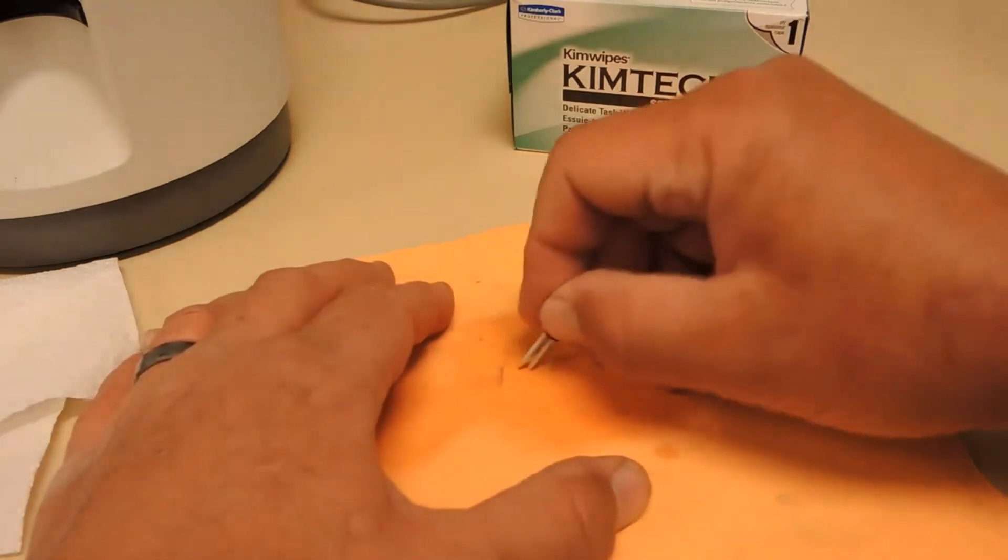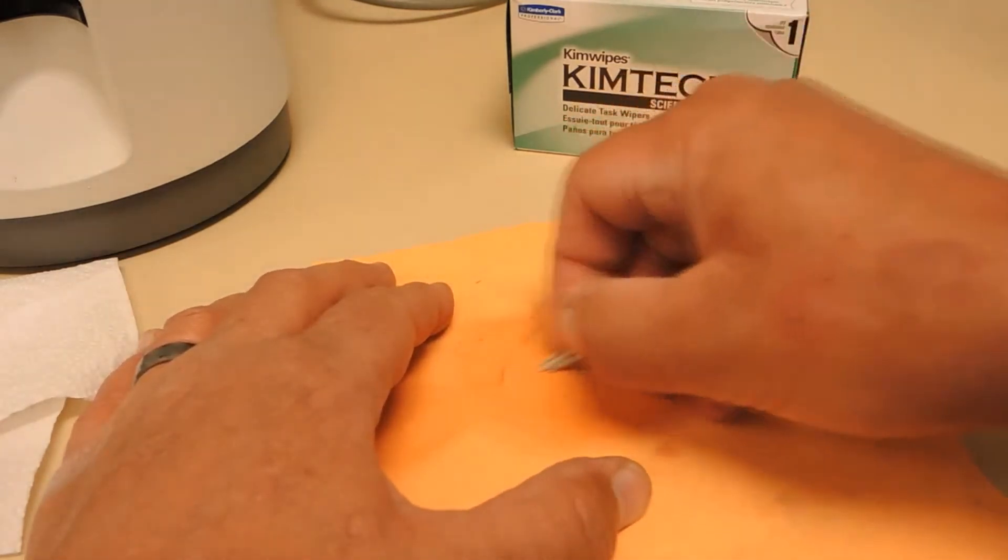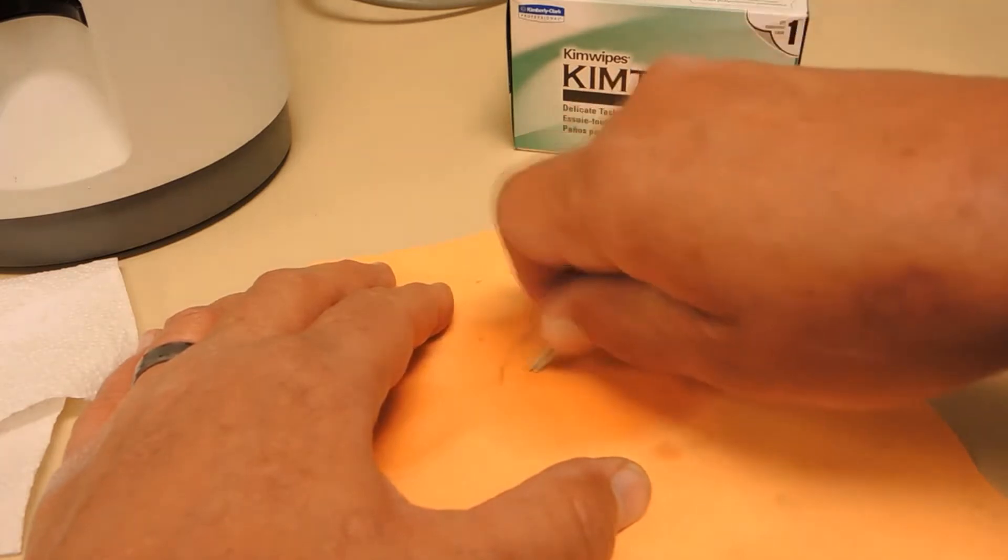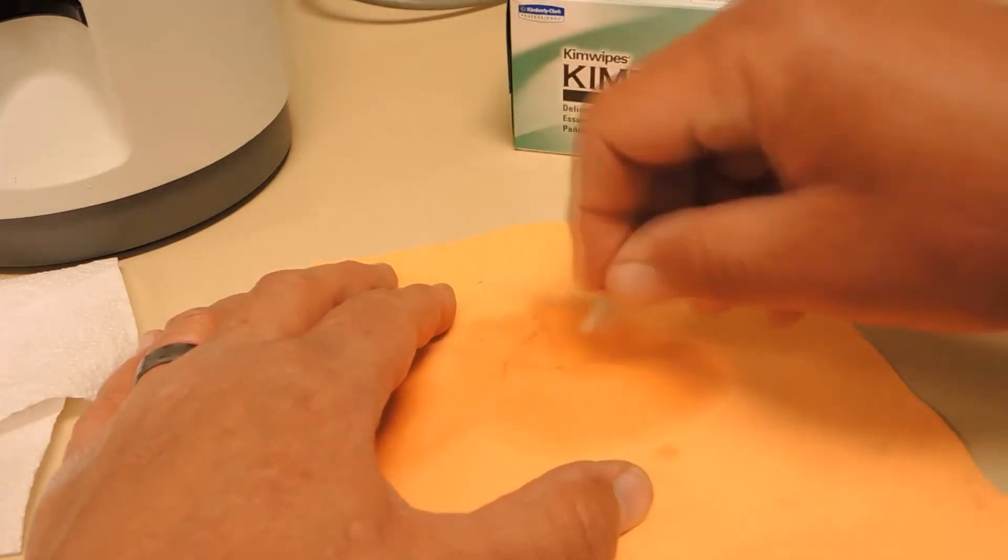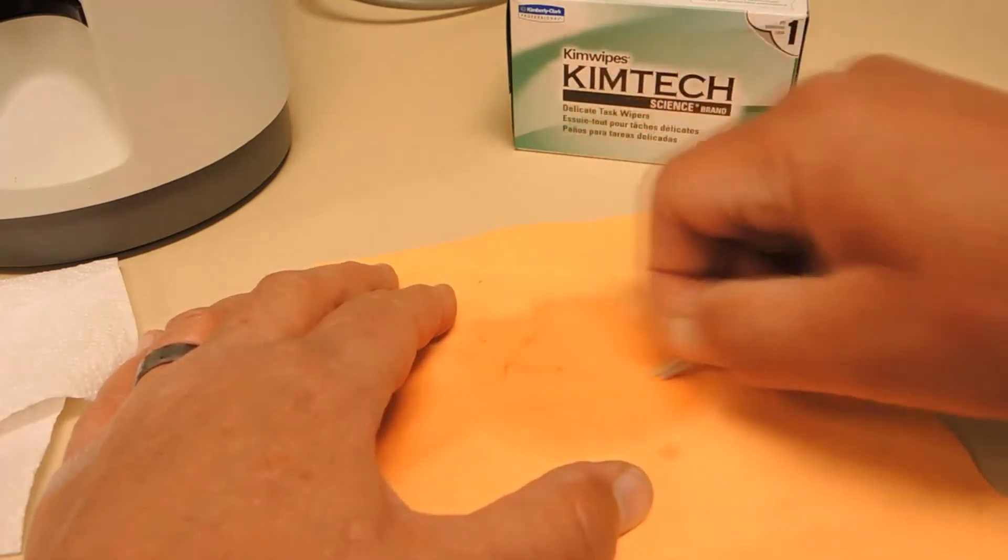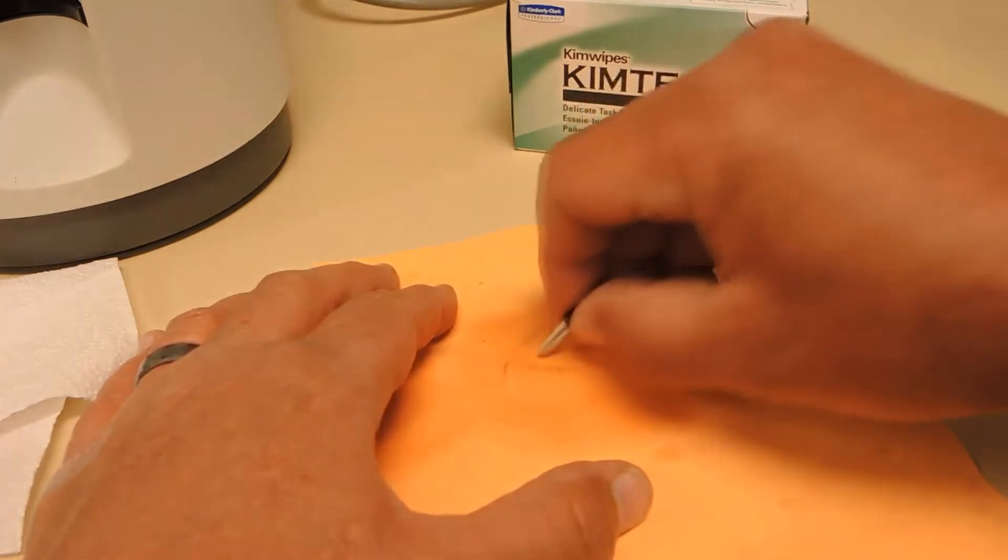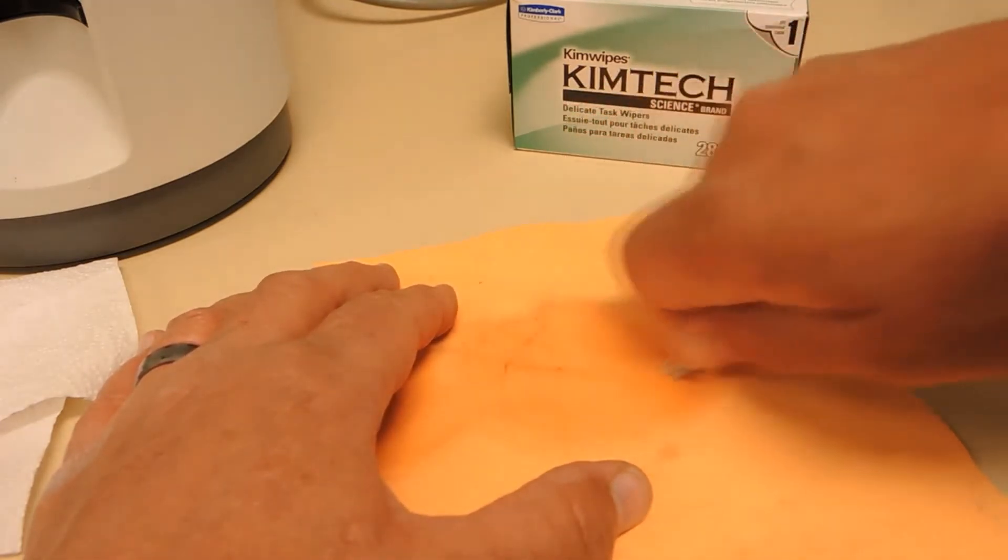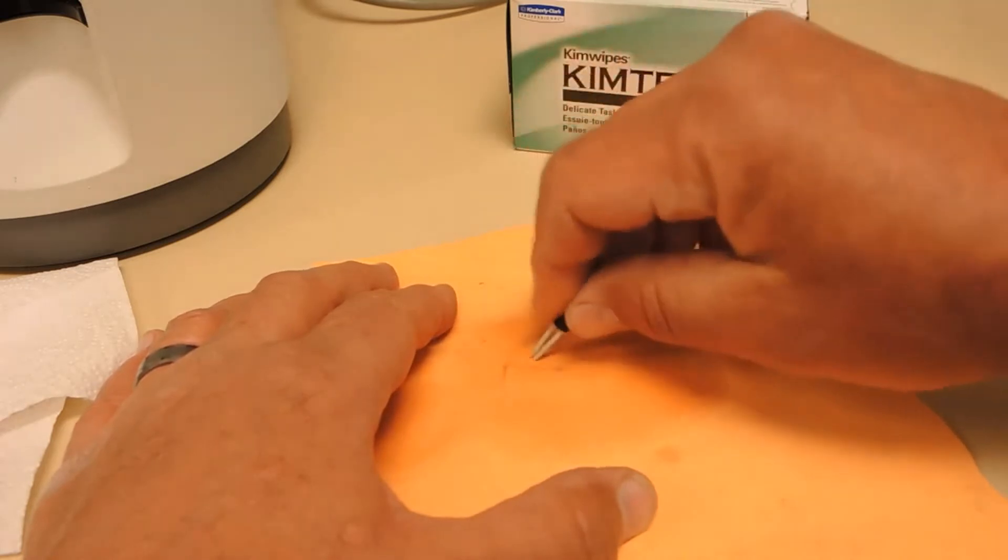Now we'll do the measurement electrode. Same process. Dragging it and then raising your hand at the end of the stroke so that you get the very tips cleaned off as well.